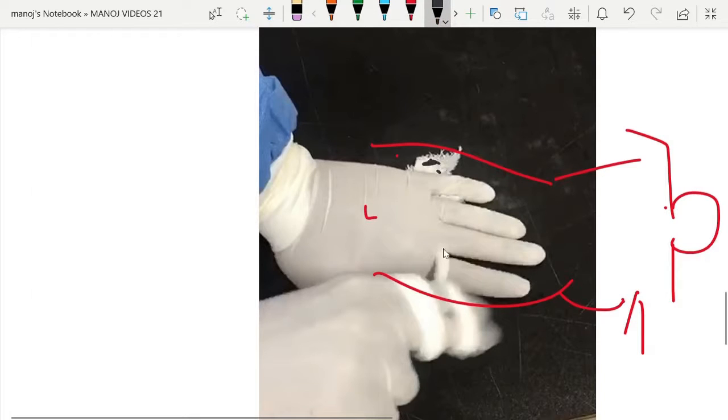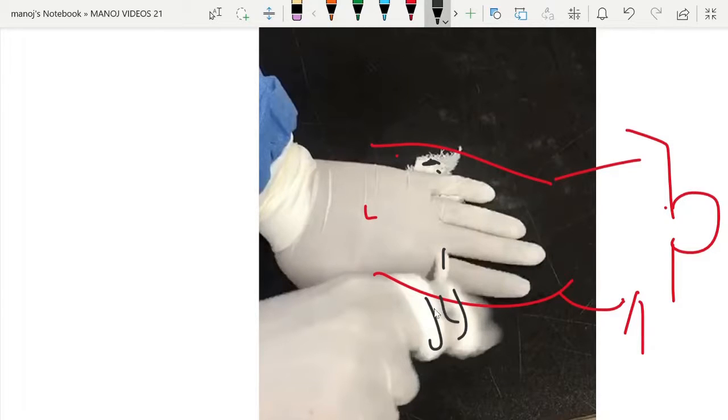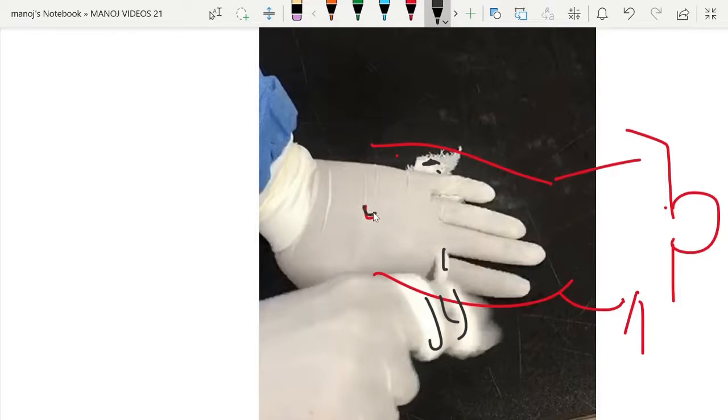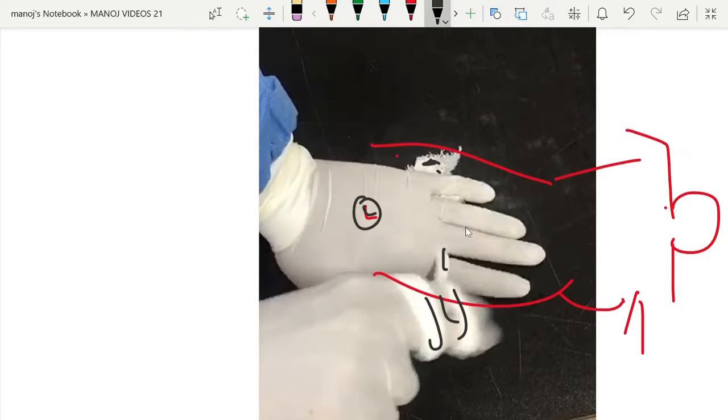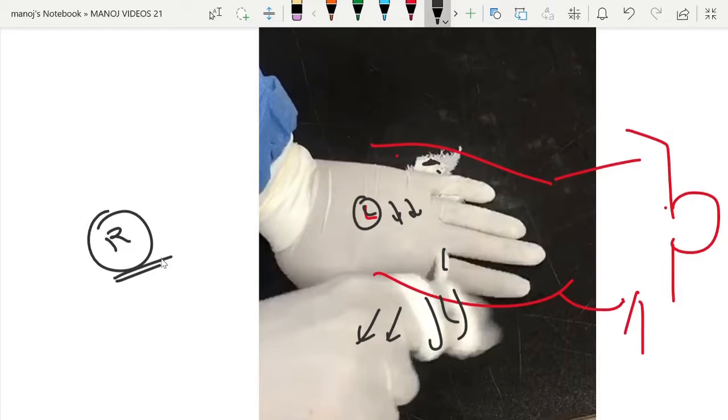Suppose if the patient is lying like this, the catheter goes like this. Place the catheter, we have to rotate it in our hand like this, so that more power can be given through the pulling. And this left hand, or one hand, has to give pressure to the abdomen like downward pressure. With this, you pull it.